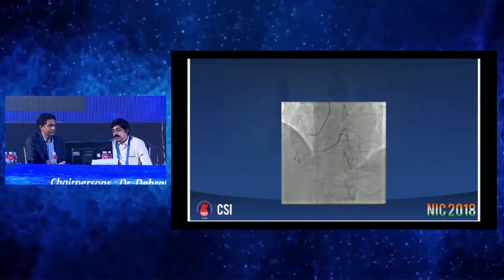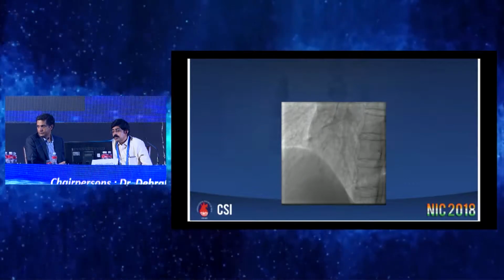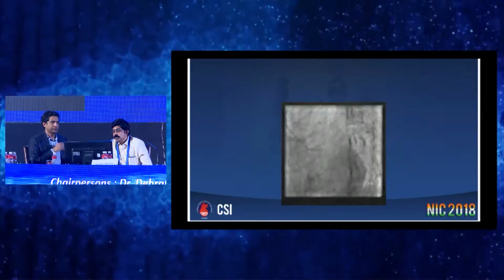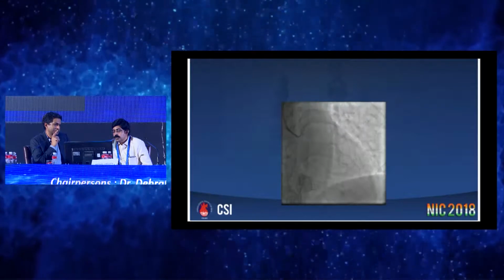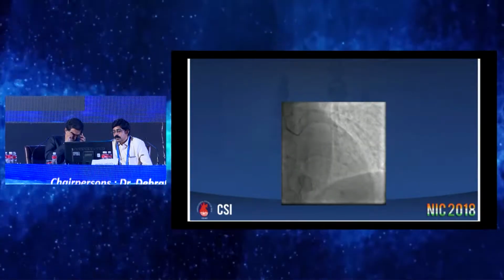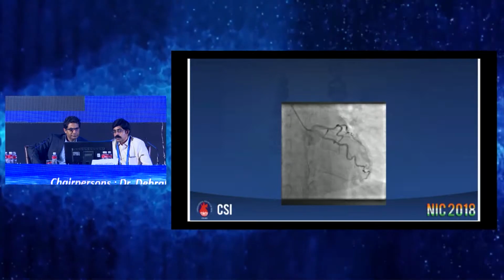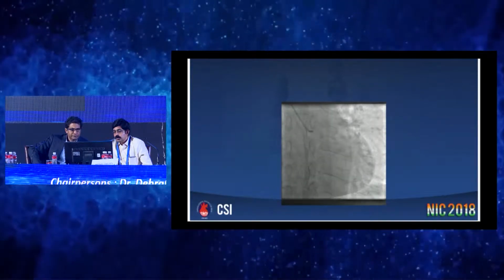That's the right coronary artery, which shows a significant long segment lesion. Next, please. Then you have an LAD, which is a long lesion again, especially at 2 points, before the diagonal and after the diagonal. And this is like a borderline lesion.